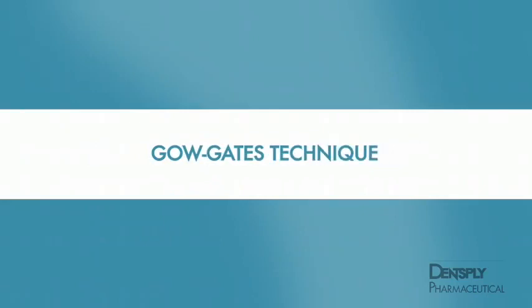the needle. Gowgates' Technique, Part 2.